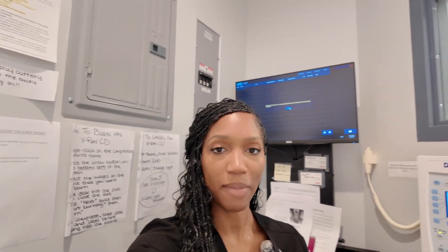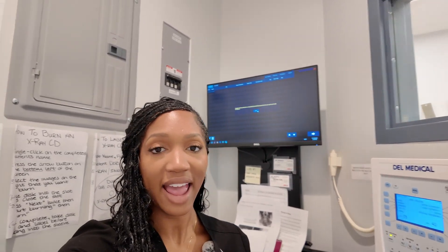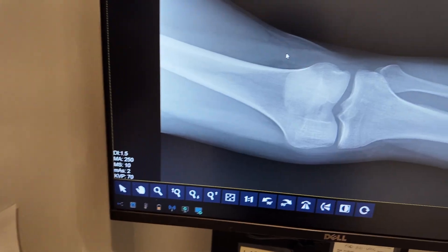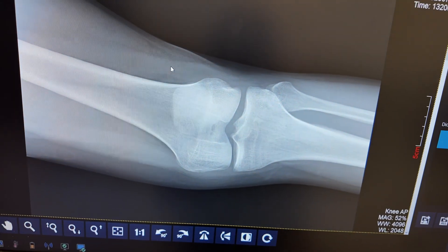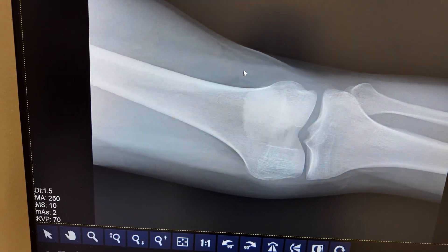The medical assistants will typically call me back into this area after they get the images, and I review them on this screen — making sure I have all the views I would like and that the patient positioning is okay — and then the medical assistant goes ahead and submits the images for review.